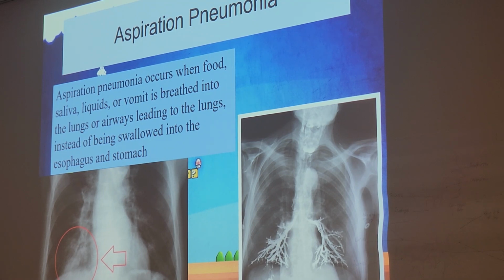Is that really contrast? That's contrast. So that's when it choked on contrast and aspirated it. They gotta go into surgery, don't they? Yeah, that would need to go to surgery. That's very dangerous, because you see how much is in there? A person probably can't hardly breathe at all. How do they get it out? They can suction it out. That wonderful suction noise.